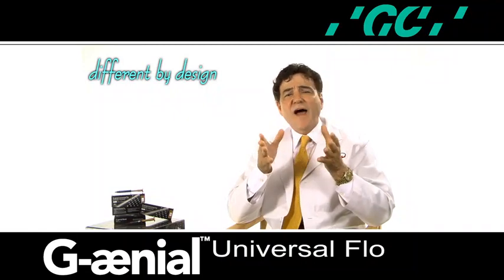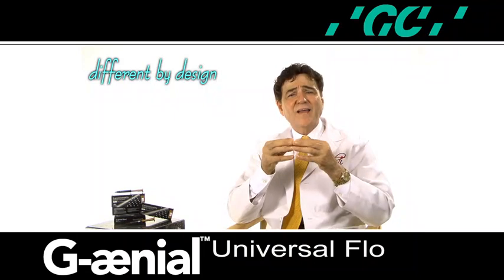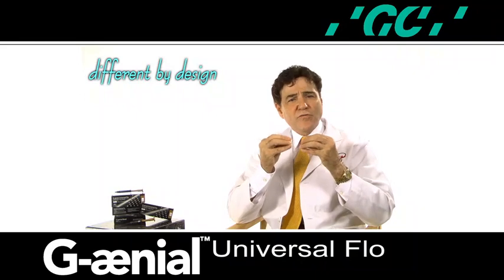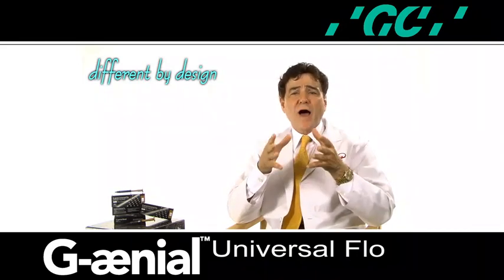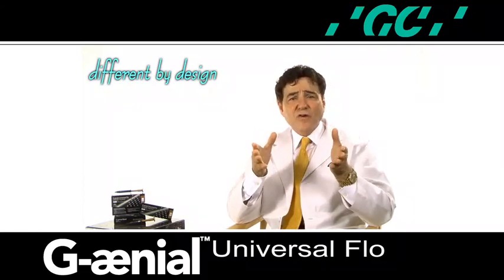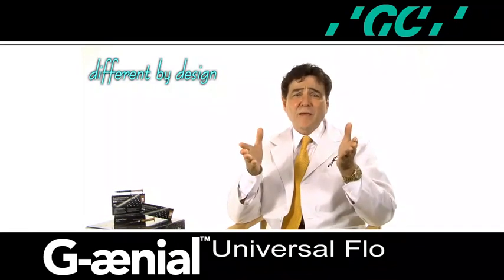A clear vinyl polysiloxane impression material can be used to replicate the diagnostic wax-up. The matrix can be placed intraorally and used as a transfer vehicle for the flowable composite to be injected and cured. After adjustment and polishing procedures are completed, the transitional restorations can continue to be modified to satisfy the functional and aesthetic needs of the patient and the interdisciplinary team.